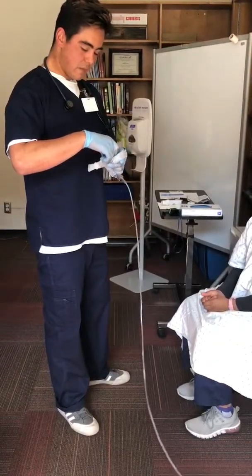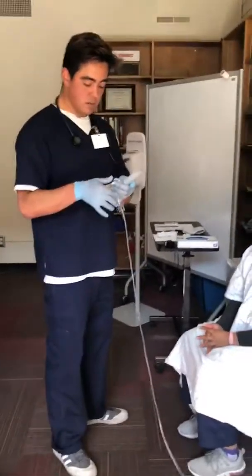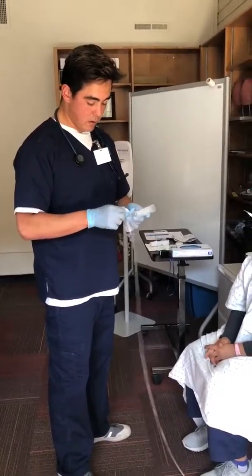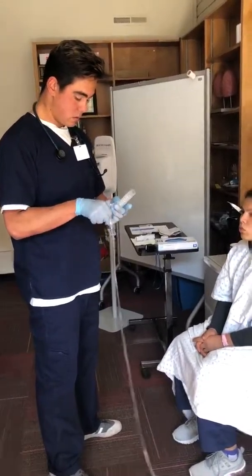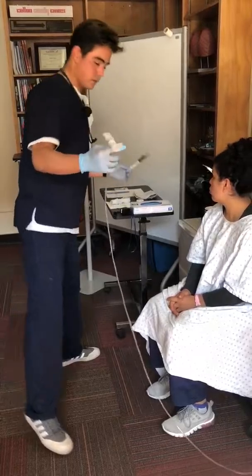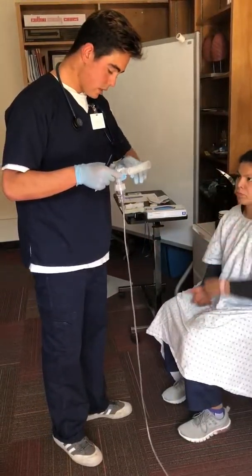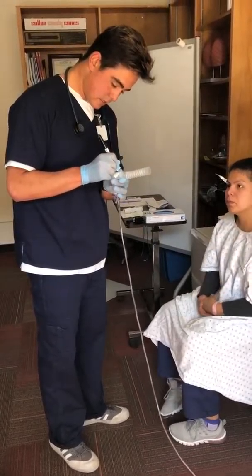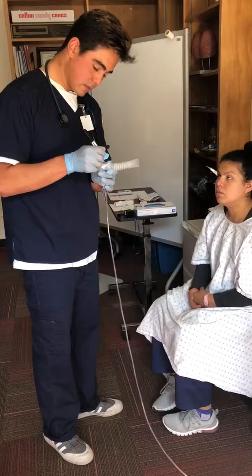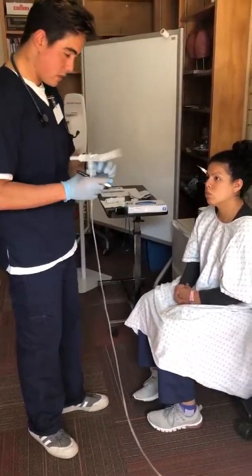So we want the date of setup as well as the date of expiration. So that should be 1 week from now. If it's contaminated, we can go ahead and do that earlier. Right on this. Today's date, 11/6, and the date of expiration would be 11/13, recommended expiration.